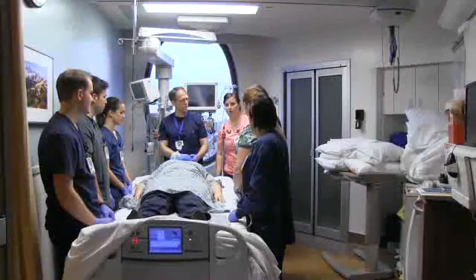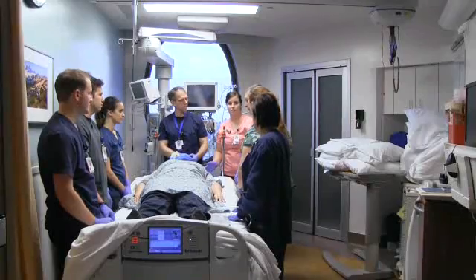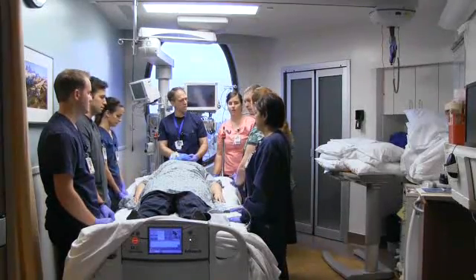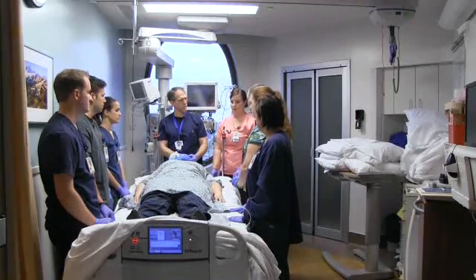When getting ready to prone the patient, there's some prep work that has to happen. It's best for the primary nurse to gather all of the supplies ahead of time. There's a list of supplies in the policy that we've written down, and that can be accessed pretty easily. We'll have it in the room available when we prone these patients.